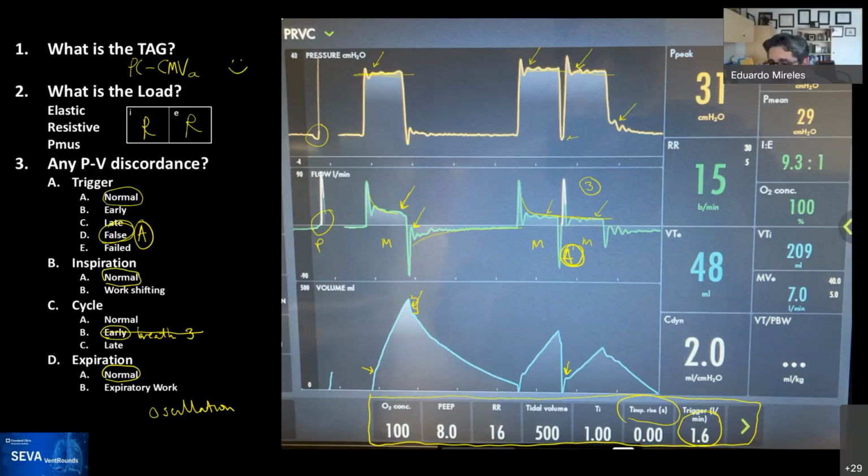Yeah, and Ariel, I don't have a problem using volume control sometimes, as long as they recognize that there's going to be varying resistances throughout the time in patients with severe obstruction, and that you want to guarantee that they will get the minimum gas exchange.